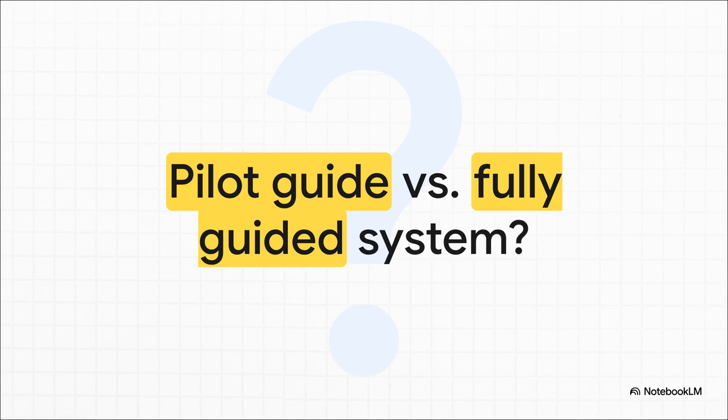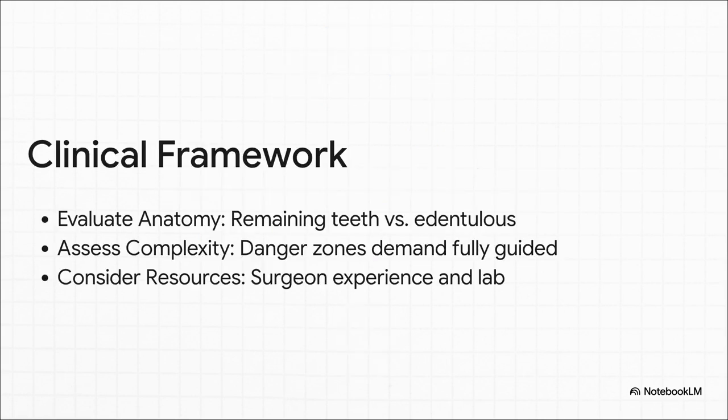So, what does this all mean? We've explored the anatomy, the drilling protocols, and the complexity scales, but now we need to answer this crucial question from our source material. How do I know when to use a pilot guide versus a fully guided system? Well, framing this final decision correctly really comes down to evaluating two things: the patient's specific anatomy and your own surgical goals. Here is the final clinical framework for you to take away and use.